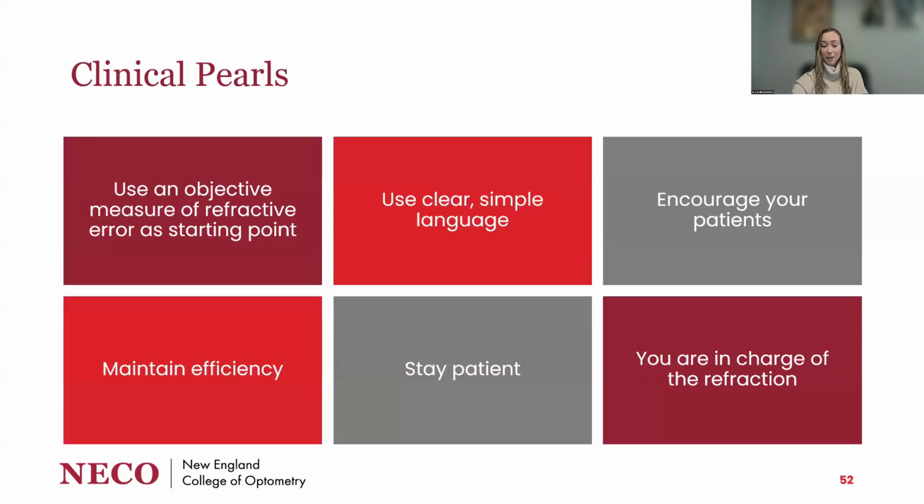Slower responses also mean that you're likely getting close. If they can't tell which one looks significantly more clear, it means that we're very close to our endpoint, and that's a good sign. So stay patient with your patients. You're the doctor, and it's up to you to decide when to move on, and when your patient may be really anxious or not sure what the procedure is.